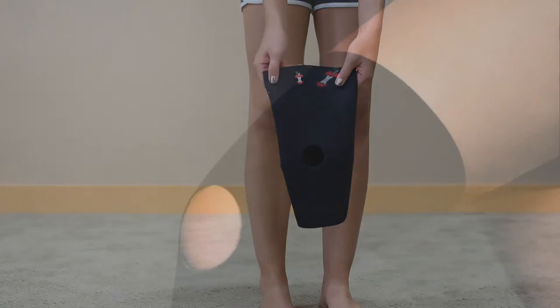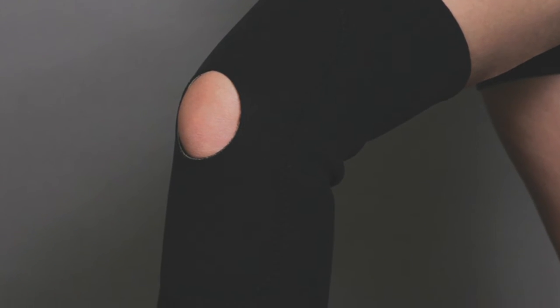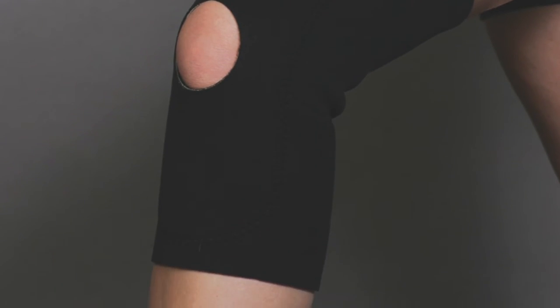The open patella has double padding surrounding the kneecap for extra compression. It is contoured, has a bilateral design, and is available in several sizes.